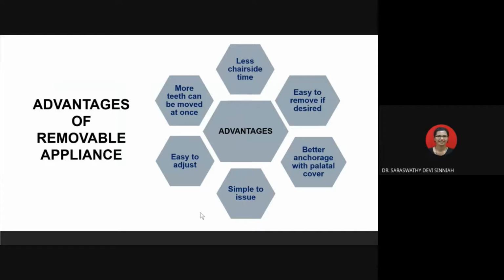The palatal anchorage in a removable appliance gives good stability. This allows more favorable tooth movement. The bigger area of acrylic coverage increases the anchorage.